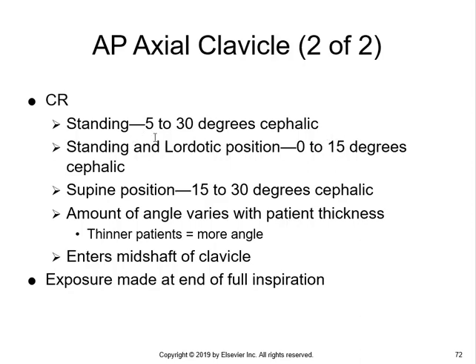So you can also have the patient lean back in a lordotic position up to 15 degrees to accomplish the same thing. I really don't recommend you do that. Leaning the patient backwards is going to be very, very painful for the patient. If you do try this, what I would recommend is to put the patient in a chair that has a back on it, not on a rolling stool, so that the patient can lean back and still be supported.